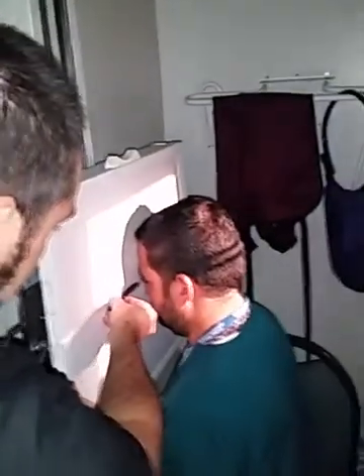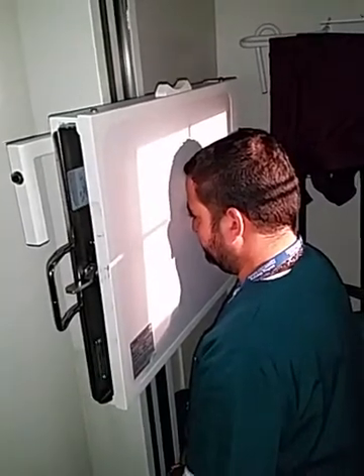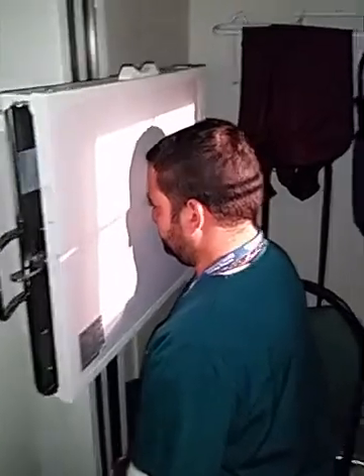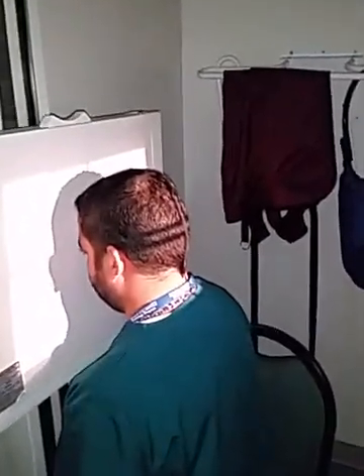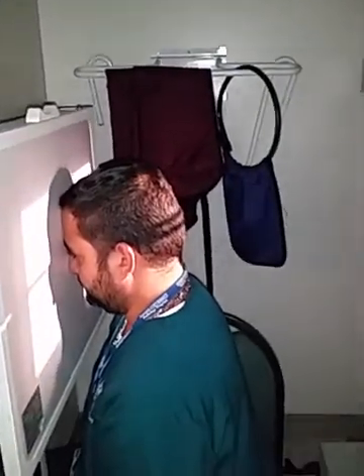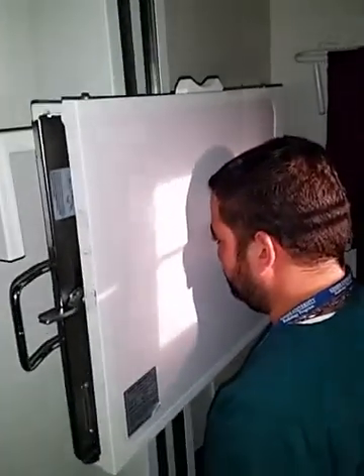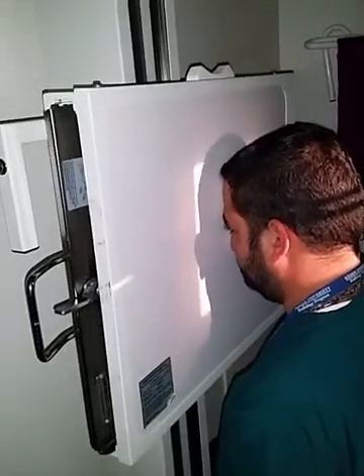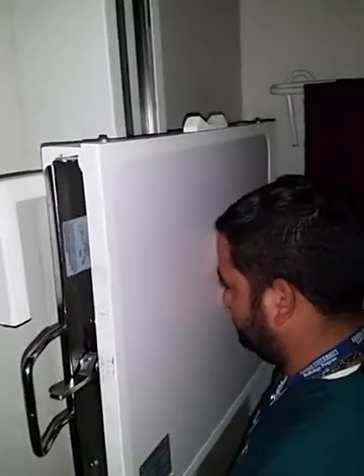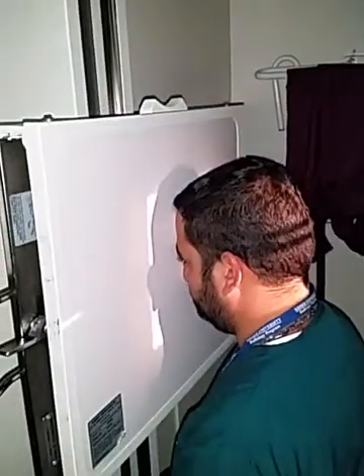And of course, that's basically take a straight edge, line it up where the anatomy is, and then make your crosshairs match. Okay, so in this case, if I wanted it to exit the nasion, it would come down maybe a quarter of an inch where it's lined up exiting his nasion. Okay, now here's the problem with this. By the book, we're going to have everything lined up exiting the nasion. But once you collimate down to like your 10 by, one of the things you're going to notice is I'm clipping now the top of his cranium. So even though by the book, this is technically right, that would be a failed comp.